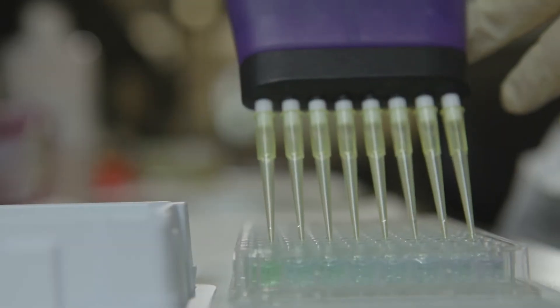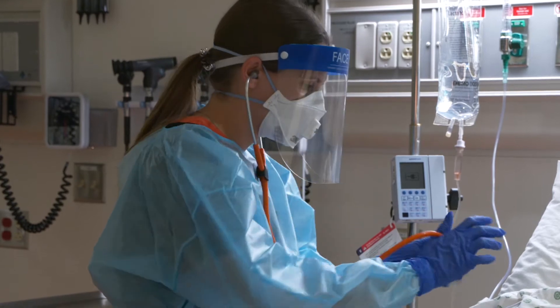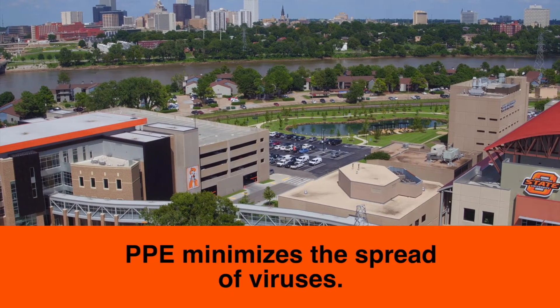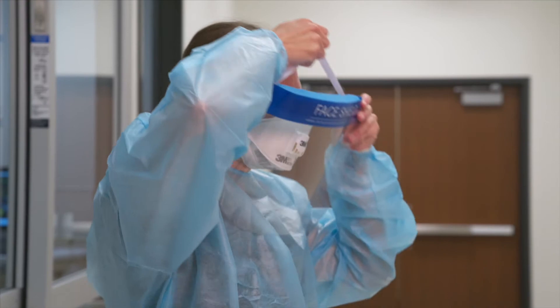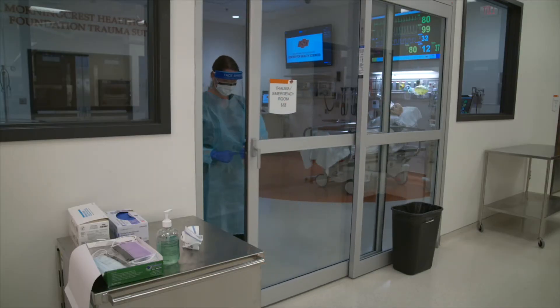Infectious diseases and personal protective equipment have both been around a long, long time. When properly worn and discarded, PPE minimizes the spread of disease like COVID-19. It's your personal responsibility to understand and practice these procedures to keep you and other health professionals and patients safe.